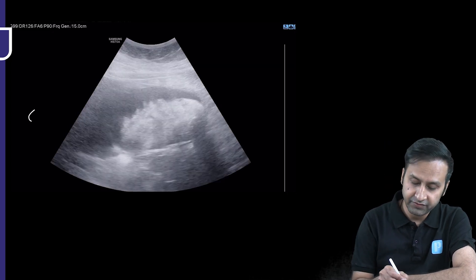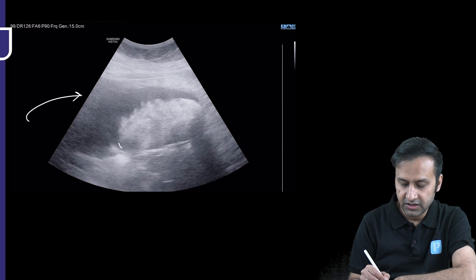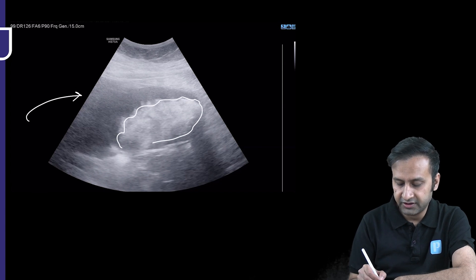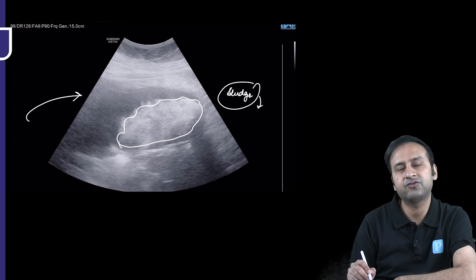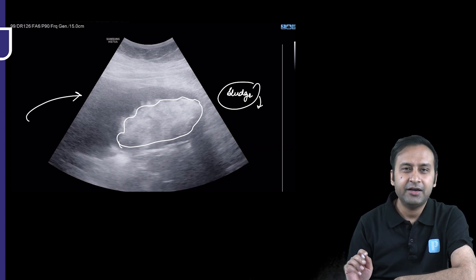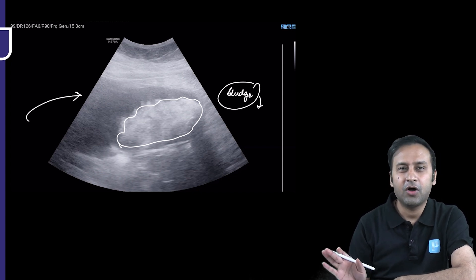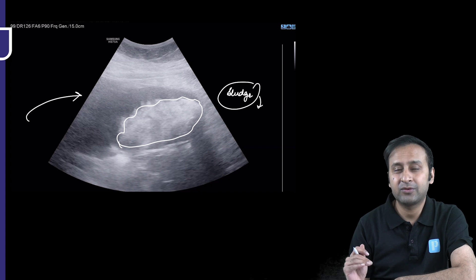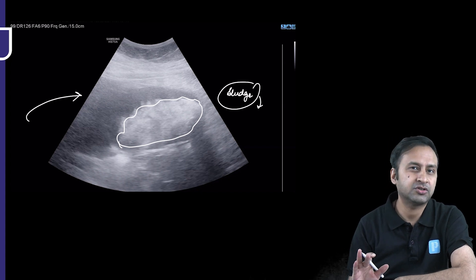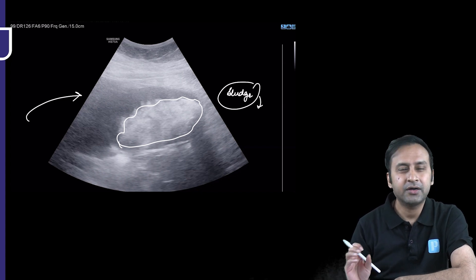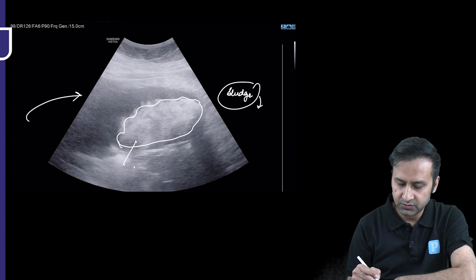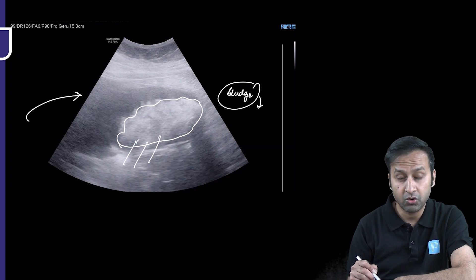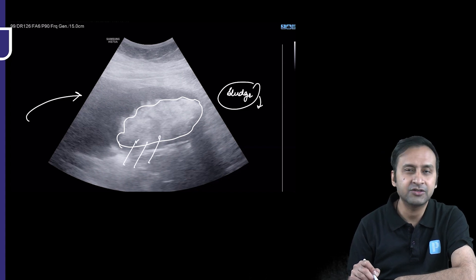We then proceeded to sonography. On the sonographic image, we see tumefactive sludge filling the entire lumen of the gallbladder. Ultrasound at times makes our life so easy — anytime you have any doubt over a gallbladder pathology, always take the patient for ultrasound and you can get answers to the majority of your questions.